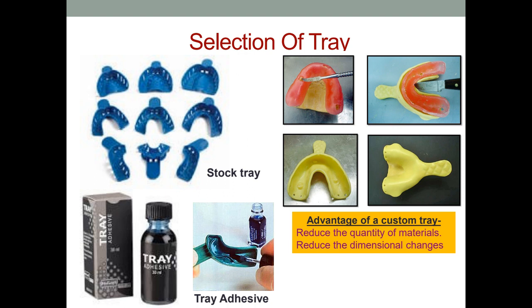What is the importance of the tissue stop? If you see in the cast, where there is no spacer, these two tissue stops are maintaining the thickness which you provided for the material. So it is very important to make tissue stops. Otherwise, when you remove the spacer and try to make an impression, the impression tray will seat with no space for the material and your impression is going to be destroyed.